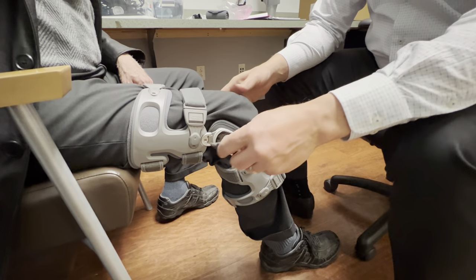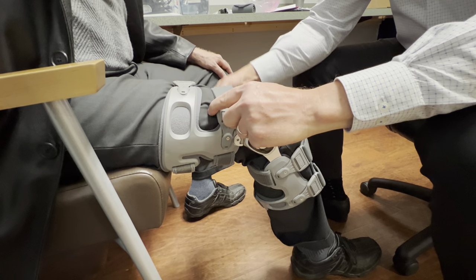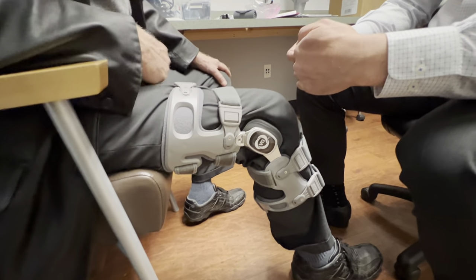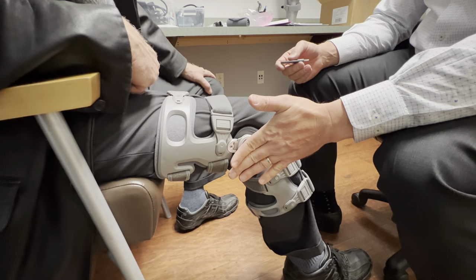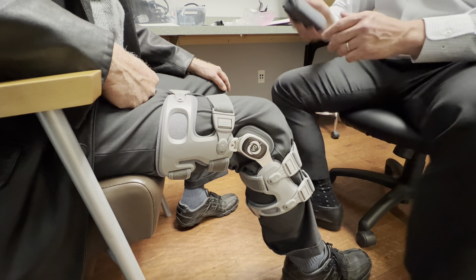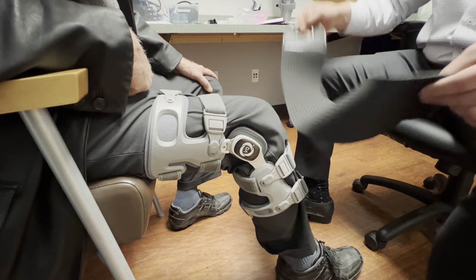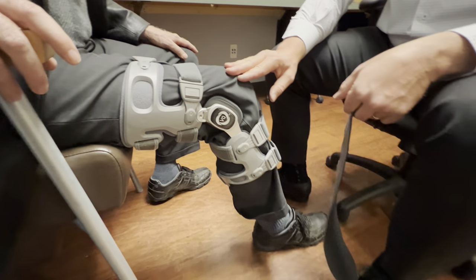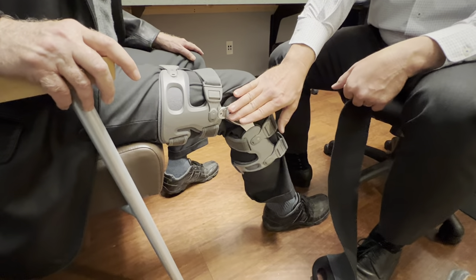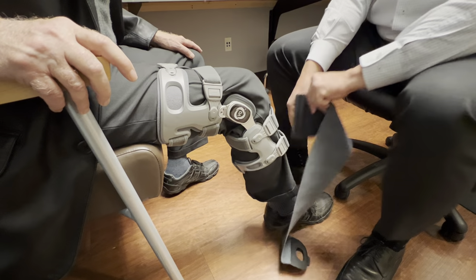Now we're going to apply the correction. What this does is apply pressure on that joint, pushing your knee this way — correcting that bow leg and making your knee more straight. We generally don't have you mess with this much; we would prefer to be the ones to adjust it. If we put too much pressure in the beginning it'll be difficult and your knee would probably be more sore, so I'll put some mild correction in and we can add more later after your knee gets used to it.